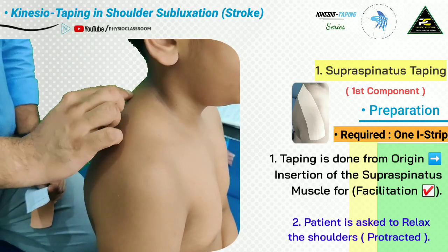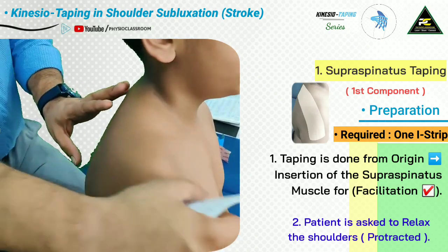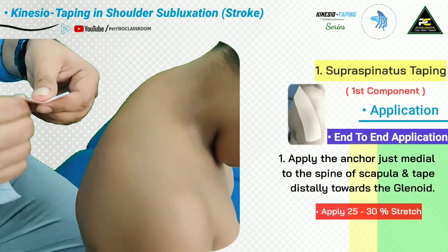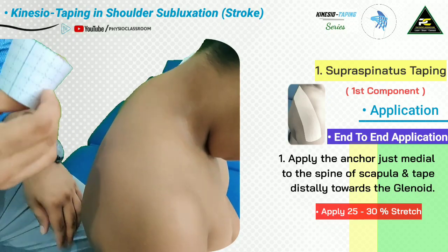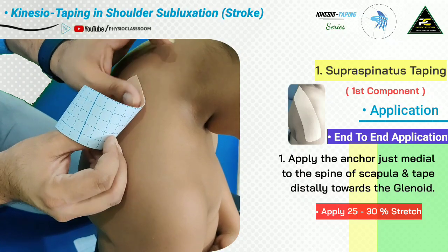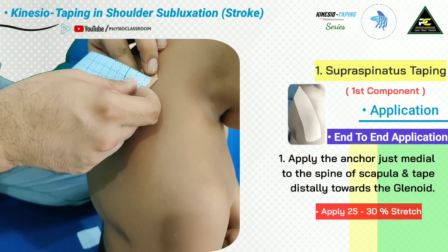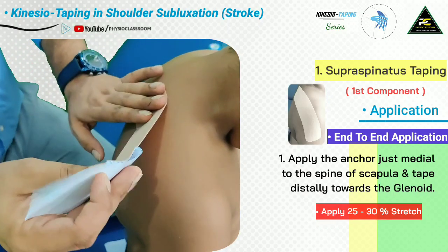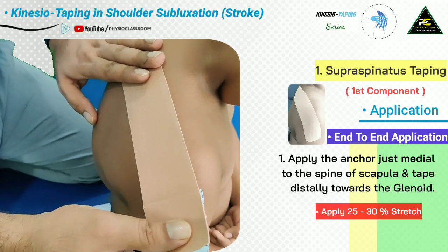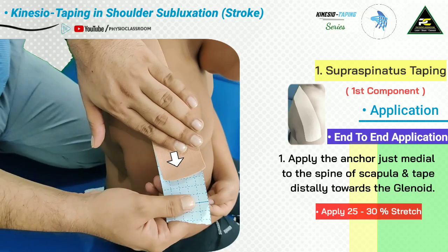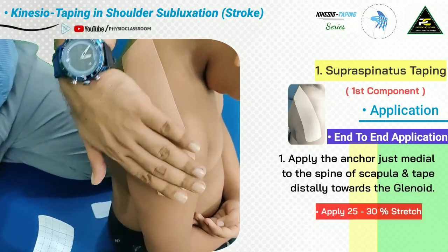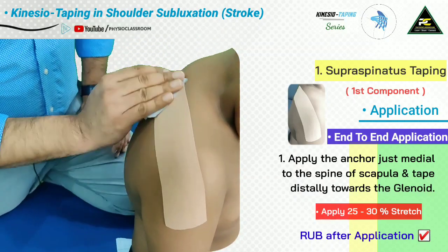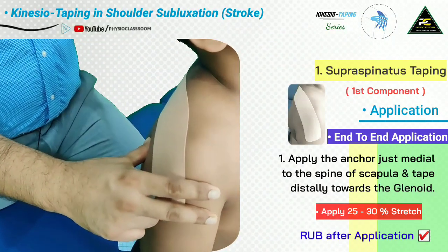Before the application, the overlying skin is stretched by asking the patient to sit in a relaxed posture so that the shoulders are protracted. We then tear the anchor and apply it just medial to the spine of the scapula. We remove the paper backing, leaving some for the distal anchor, then apply around 25 to 30 percent stretch. The last part is applied with no stretch. Rub the tape to ensure adherence by activating the glue, then return the patient to the neutral position.